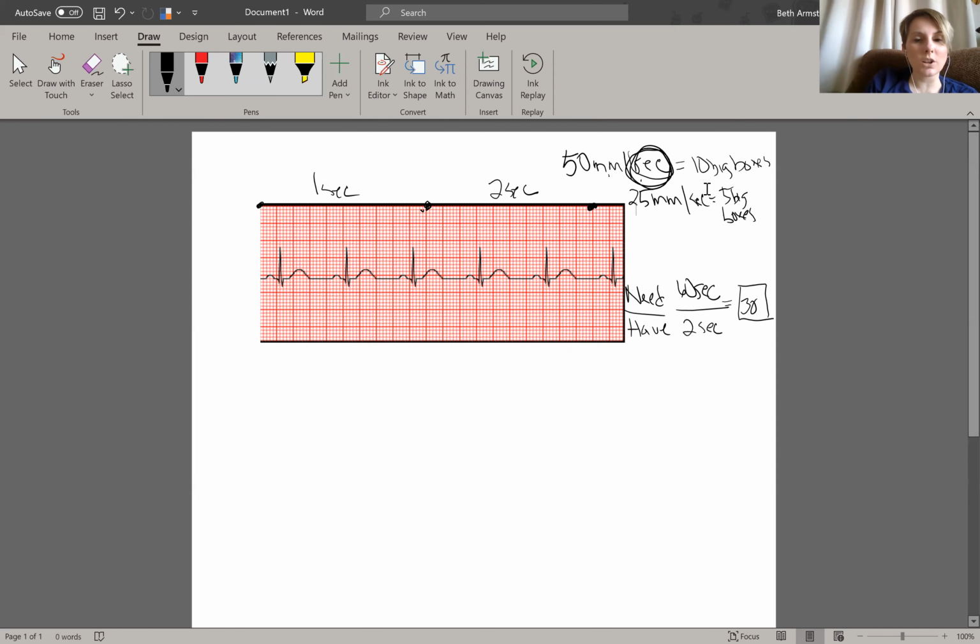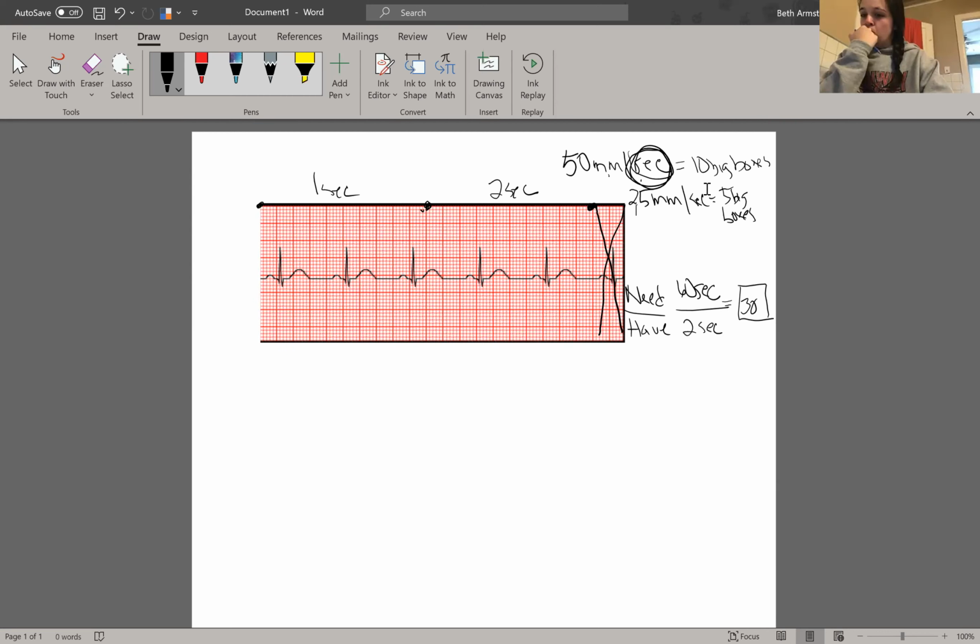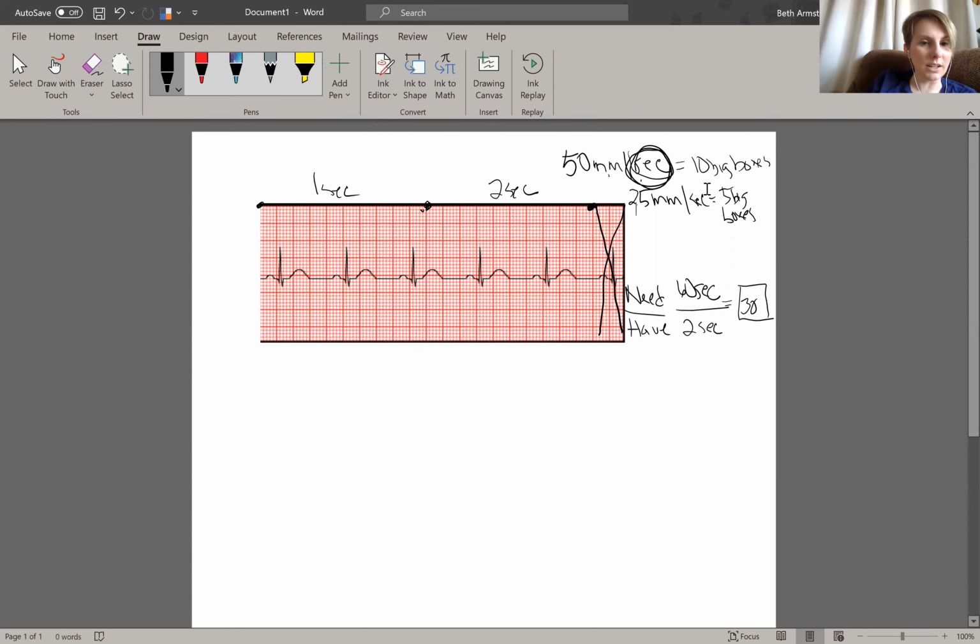So if you're just counting, like obviously if it continued to go and there were 10 additional big boxes, we could continue to go, but we just stopped here. And so we're not going to count anything after this point. Oh, do you mean at this area right here?